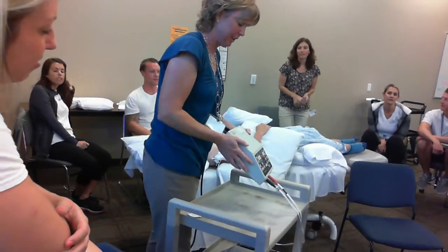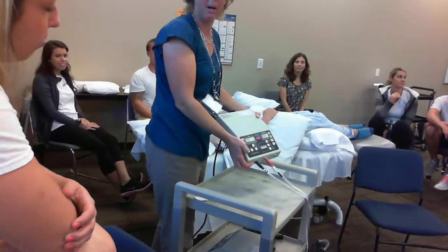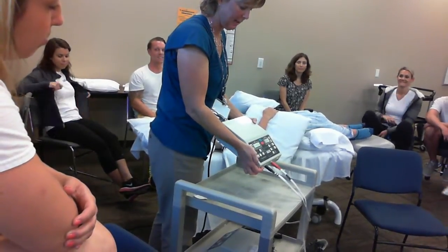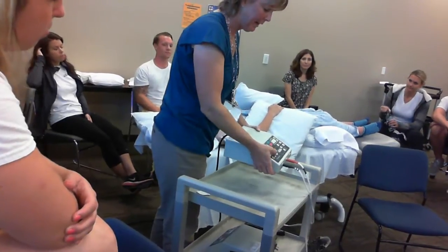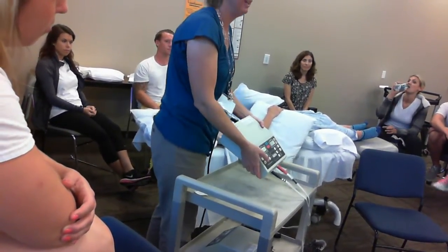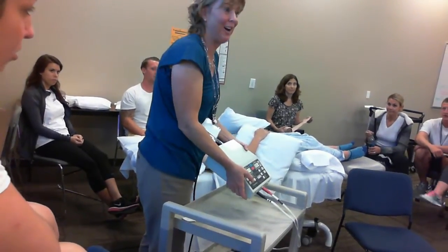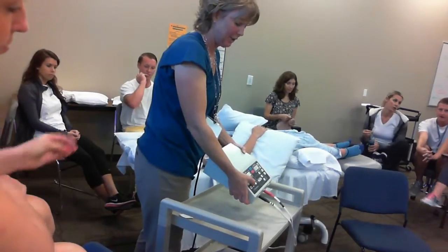Okay, so the machine. Over here on the left-hand side, you'll see a little button that says IFC or pre-mod. Hit it once, IFC lights up. And then, you guys are so lucky, it says high or low. What is that talking about? Acute or chronic, high rate, low rate. We're using an acute patient scenario right here, so high rate.